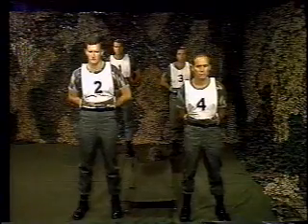Once they have cleared that obstacle, they would then simply give the command, 4-person carry move. At that time, the 4 team members could then move back out to their original positions, and again, the team leader, using portions of his body, would talk the team down. Demonstration team. Prepare to lift. Lift.